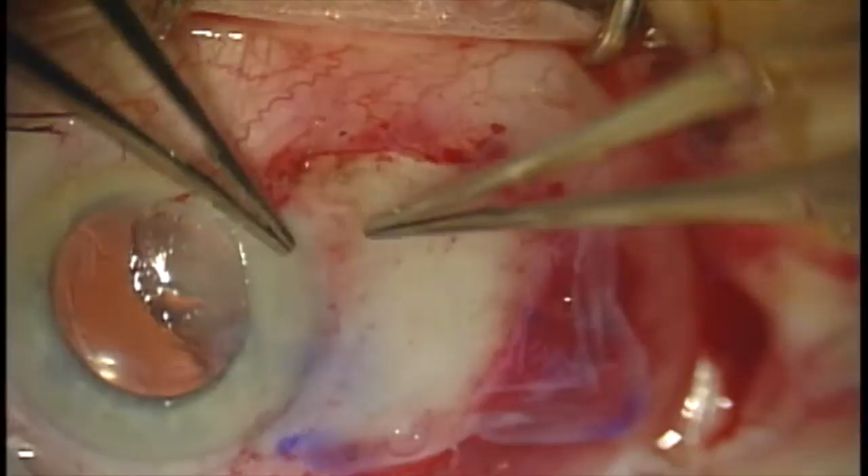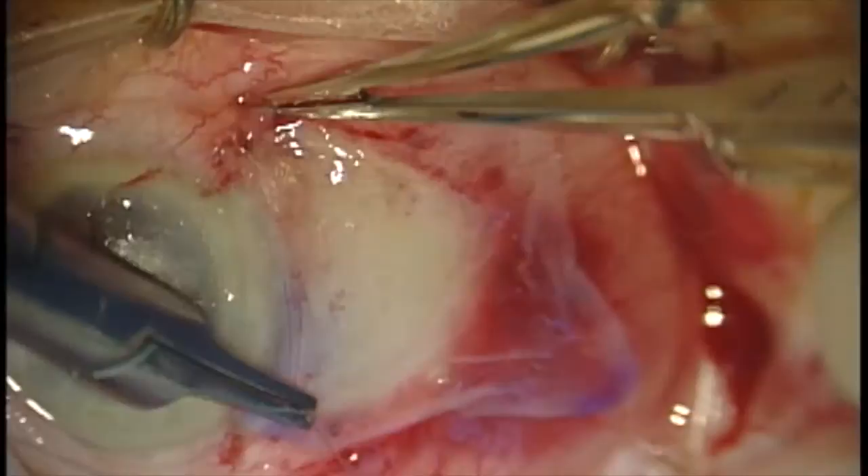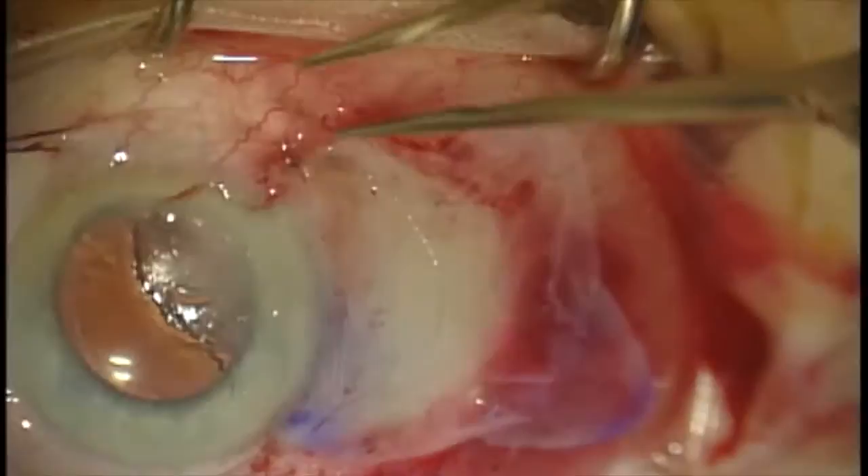I like to secure the graft with at least two interrupted Vicryl sutures. Some people use nylon, some people use no sutures whatsoever. But I find that two interrupted 9-0 Vicryl sutures at the limbus creates good adherence and prevents the graft from falling off in the post-operative period.